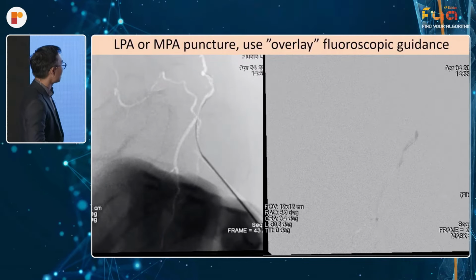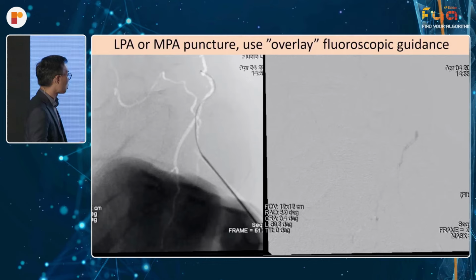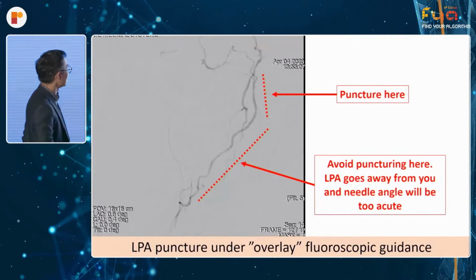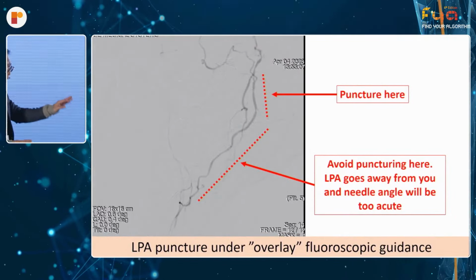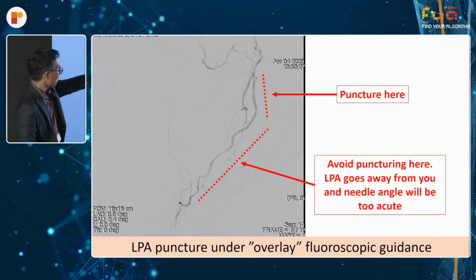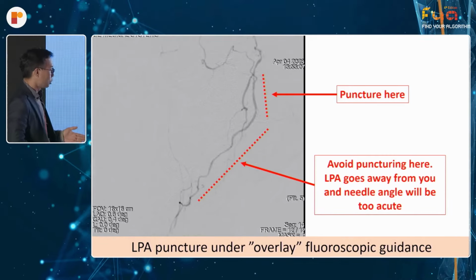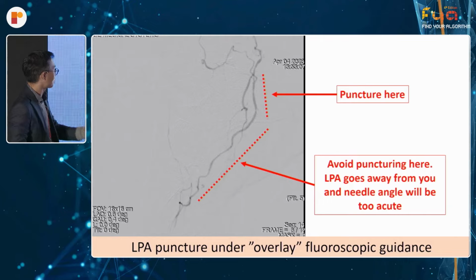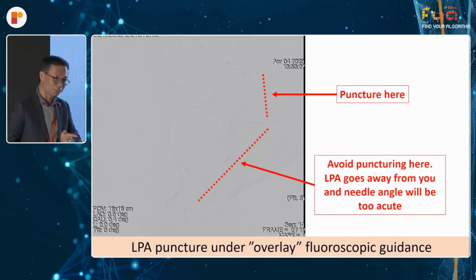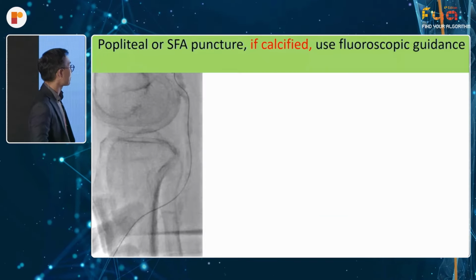LPA or MPA puncture, I also use the overlay fluoroscopic technique. I think using ultrasound is also possible, but my ultrasound skills are not good enough, so I tend to use the overlay technique. And this is a lateral projection of the foot. My tip for puncturing the lateral plantar artery is always, if possible, puncture more proximally. If you puncture distally, once it makes that bend, as the artery goes towards the other side of the foot, in this angle you can puncture it, but when you project another angle, it will be at a very, very 90-degree angle. It'll be too acute for you to pass the wire in. So that's my only tip for puncturing LPA.